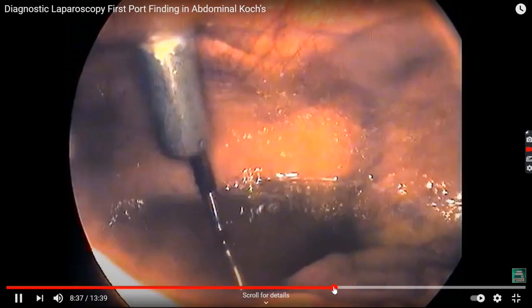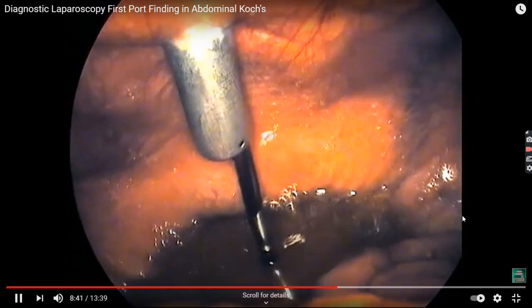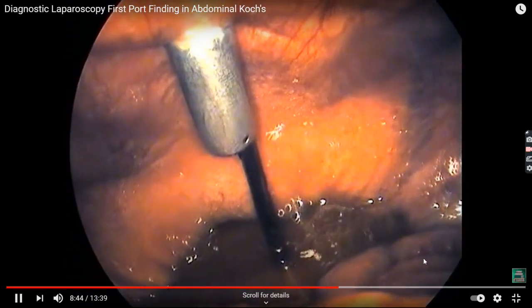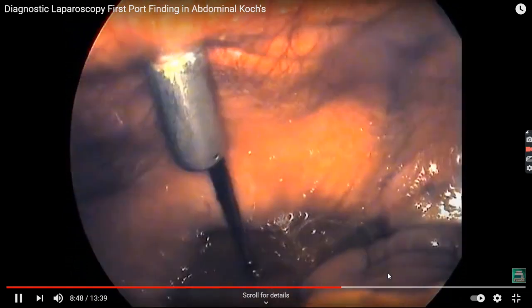The ascitic fluid is present in the dependent area in the pelvic cavity. Yes, now you can see the small intestine impression also.